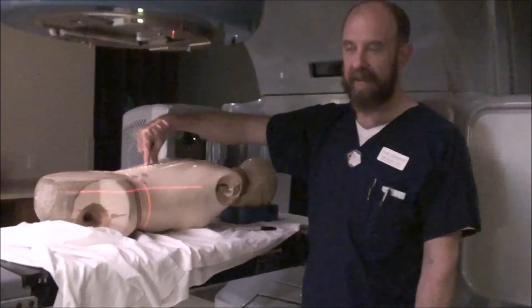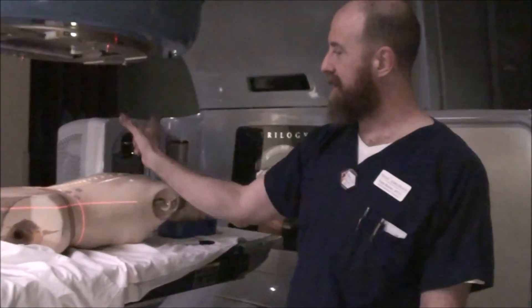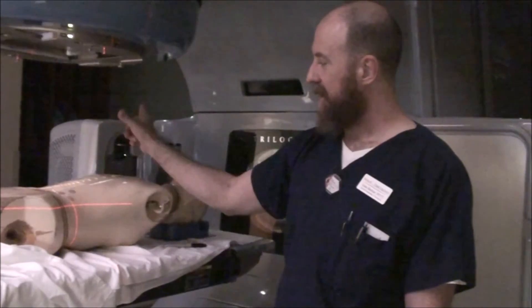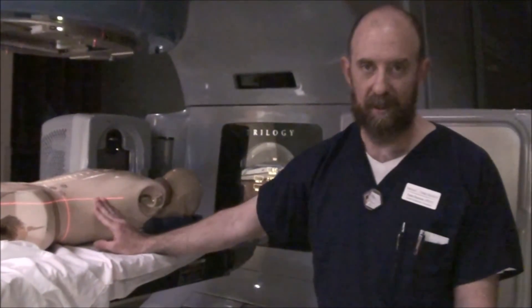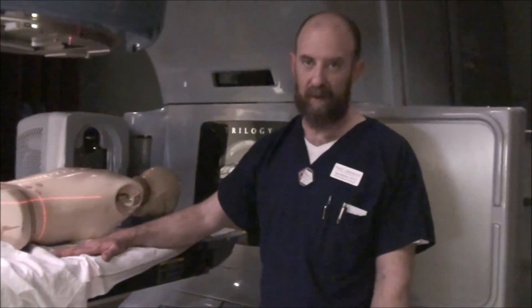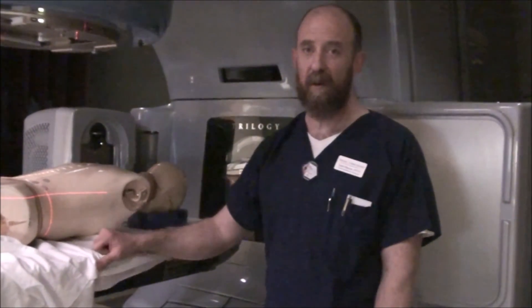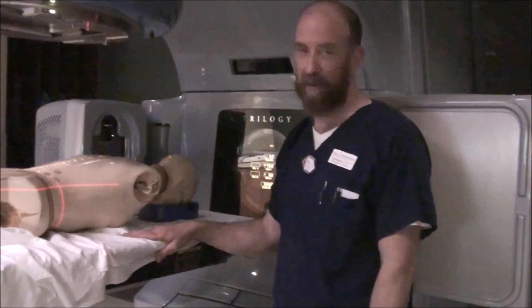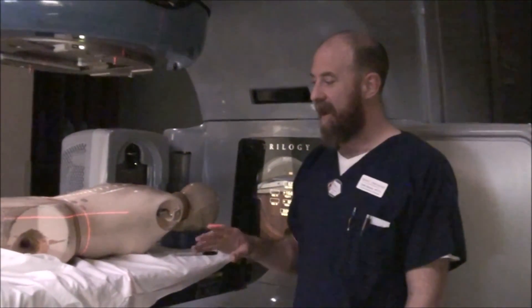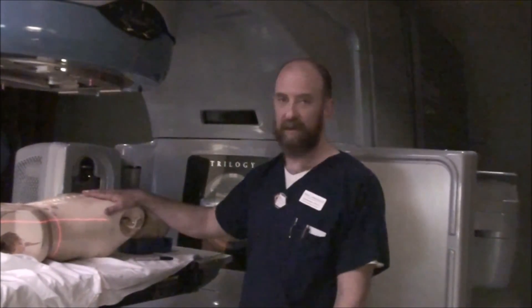You have a gap because you can't just kick the table one way and then the other to match those two fields. At depth, as you saw from the diagram in class, those fields are going to cross at some point inside the patient — you cannot avoid that. You want those fields crossing anterior to the spinal cord, not posterior. You want that hot spot to be somewhere deep inside the person's body, not at the spinal cord. Double treating the spinal cord is bad — we want to avoid that as much as possible. In an additional video I'll show you how a junction shift works, because it's easy to see on a flat sheet.